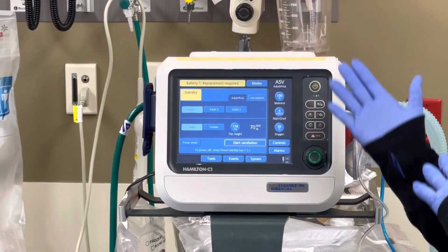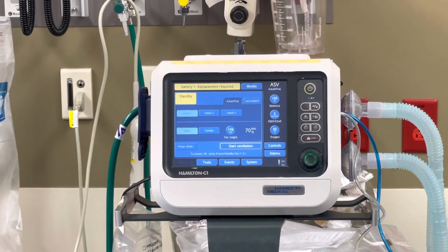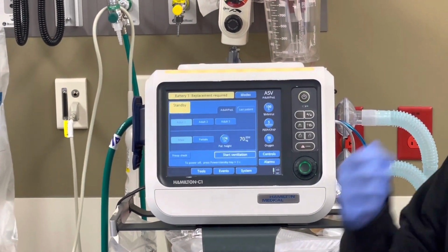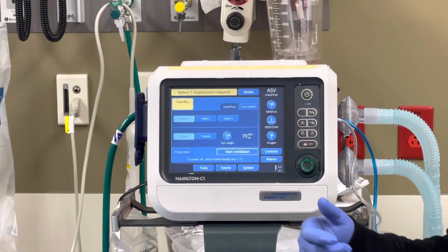And I do the same thing whenever I'm titrating the PEEP back down, because sometimes, especially in a code situation, I just need to open the lungs, but then once I have the lungs open, I can go back down. That patient doesn't necessarily need the 8 or 10 of PEEP. We just needed it initially to open up the lungs.